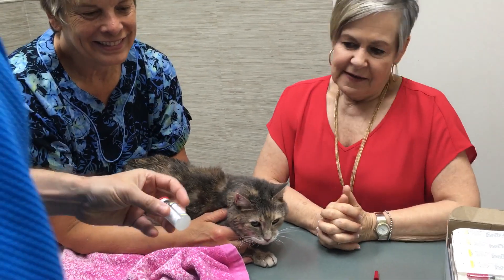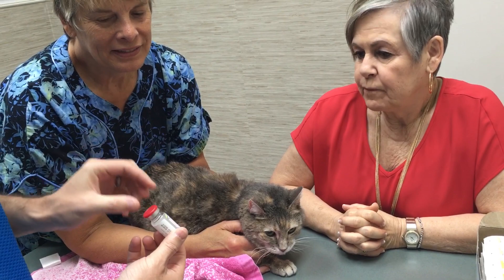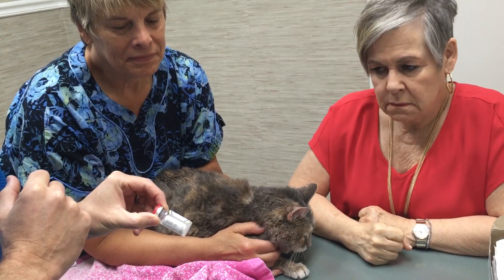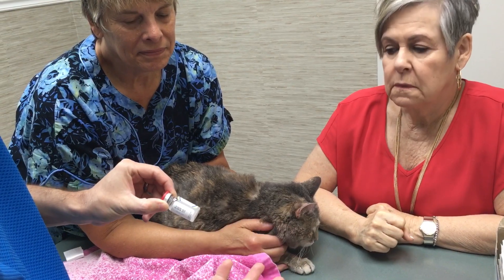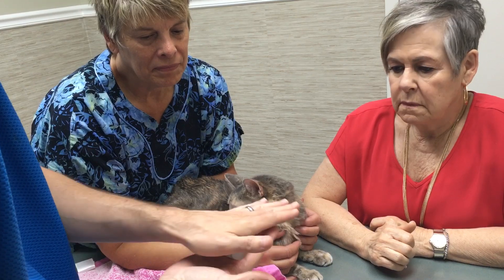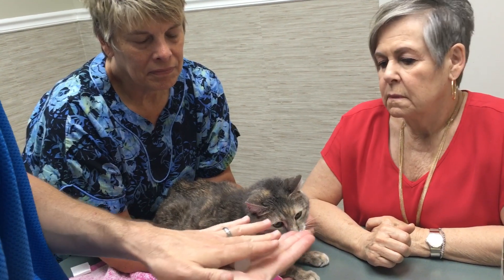Now for insulin. Insulin has to stay in the fridge. Prozine — veterinary insulin. Never shake the bottle. It is a very, very fragile molecule, and if we shake it we will actually damage it and it won't be as efficacious anymore. So we have to stir it before we use it. You lay it flat in your hand and just roll it back and forth about 10 seconds — that is how we stir it up without damaging the molecules.